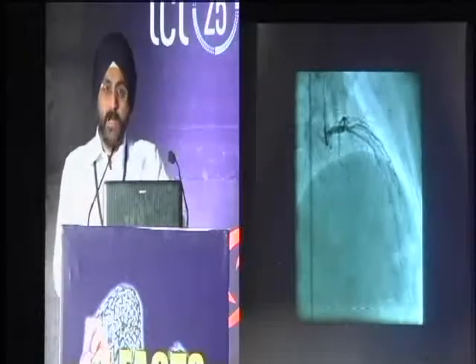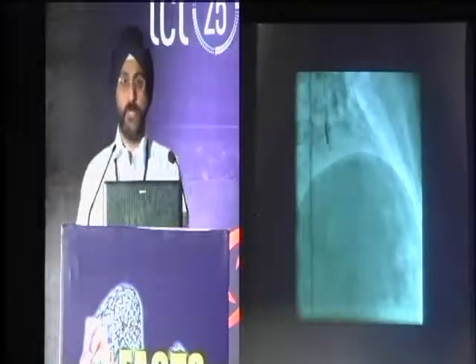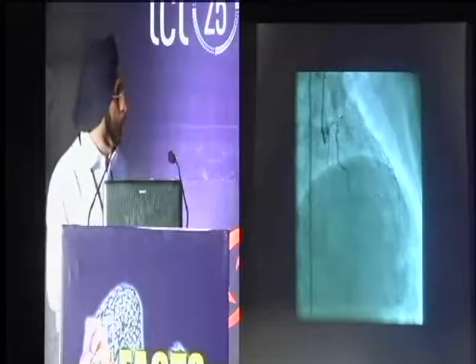So at this time, now we have to take a call whether you have to give importance to this vessel. If yes, what next? Rotablation is out of question. You have already messed up the artery. Cutting balloon, you have already perforated. You cannot dare to put a cutting balloon now.